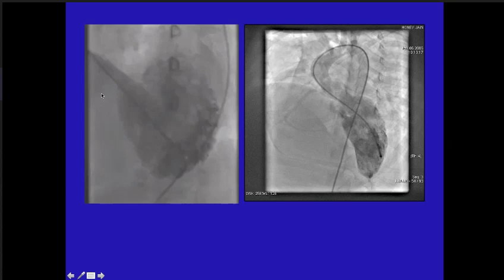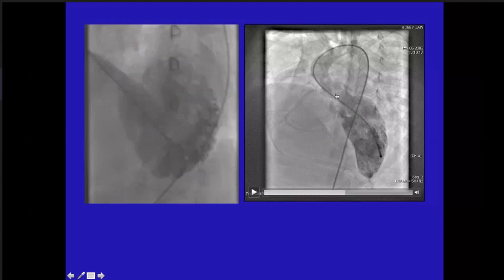Okay. Also, the aorta goes horizontally like this. Can you see this? It's going like this. So the LV outflow is foreshortened. When you look from the left side, it is shortened. So if you give cranial tilt, you can make it longer. So you get a better view of the LV outflow tract. Therefore, you give more cranial tilt if you want to elongate the ventricle and elongate the septum. You also get better views of the left ventricular outflow tract.